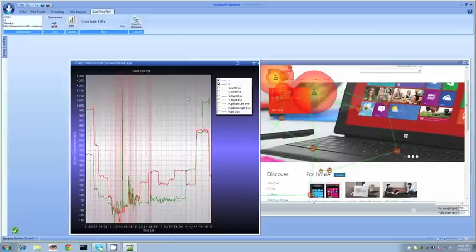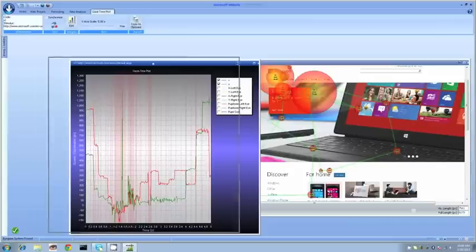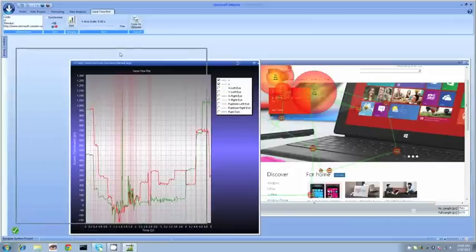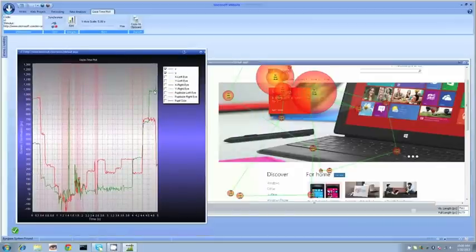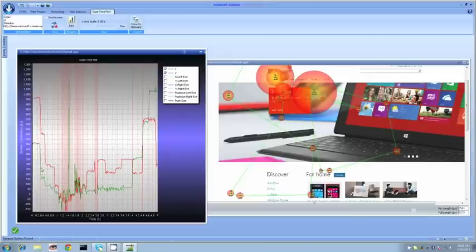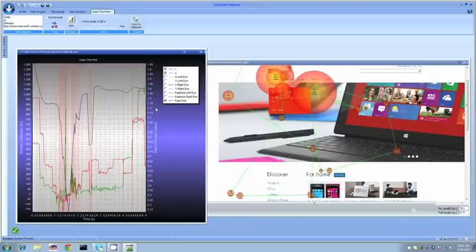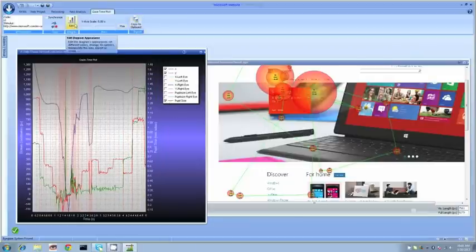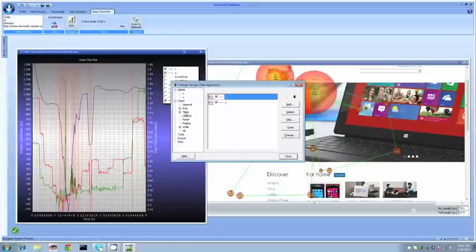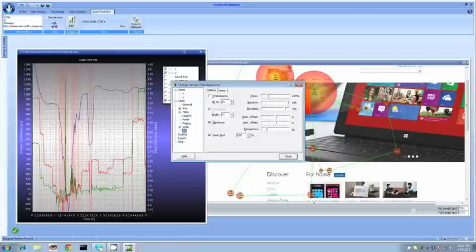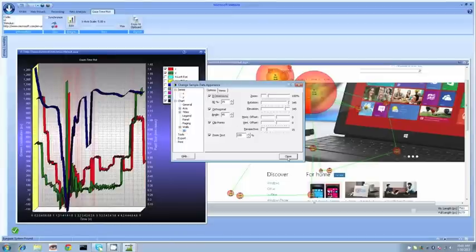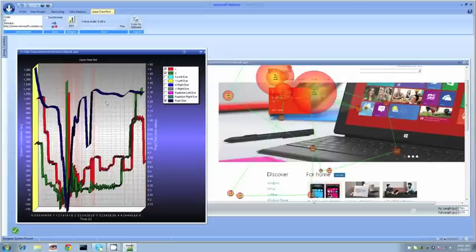We're showing you the x, y coordinates of the eyes in relation to pixels, which are on the left side of the screen, and on the bottom you have time. The red is the x coordinate, the green is the y - these are pixels over time. I'm also going to add in pupil information. This is pupil diameter in millimeters radius. I'll turn it into 3D dimensional here to make it easier to see.